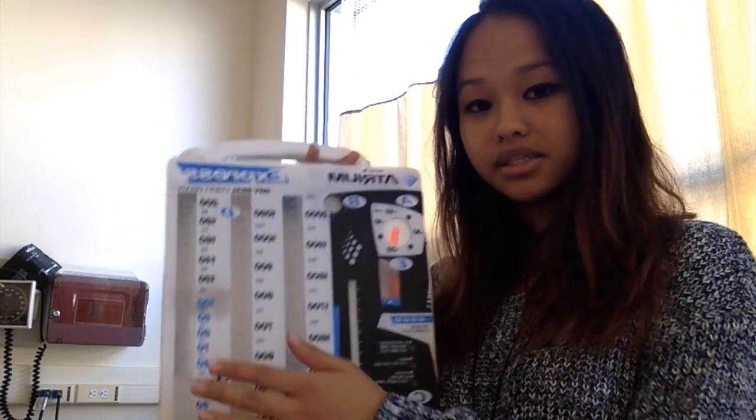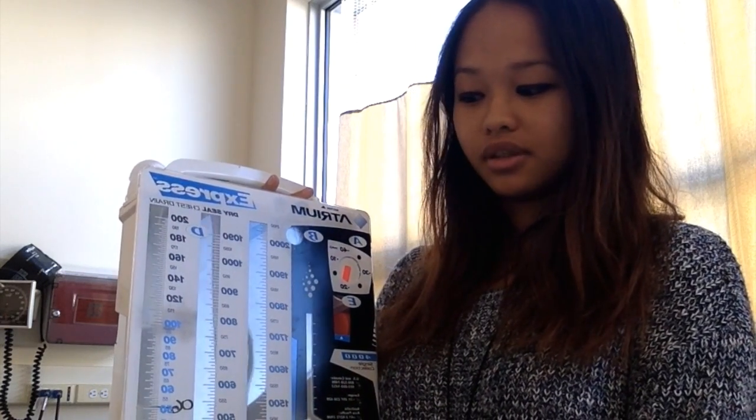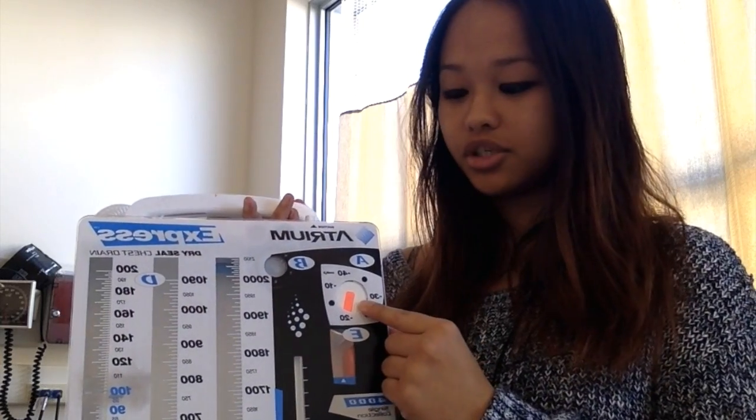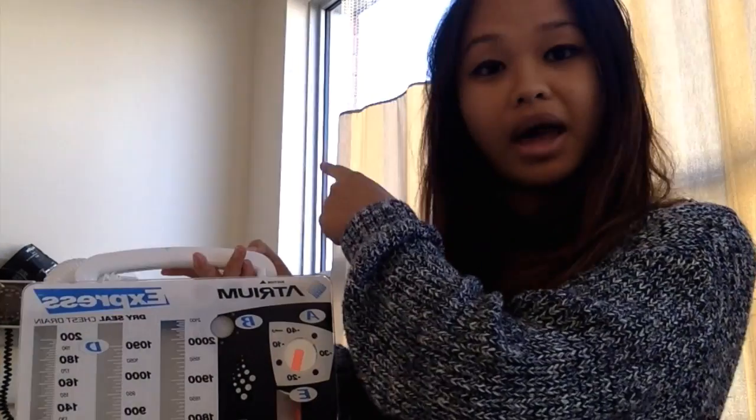And if everything is okay from there, I'm going to look at these chambers, just make sure that I make note of the fluid assessment, just the colors, the volumes, and if there's any other precipitation or any sorts. And from there, I'm going to take a look at chamber A, which this just means that the suction at the back of the room is correlated with the suction on the system.